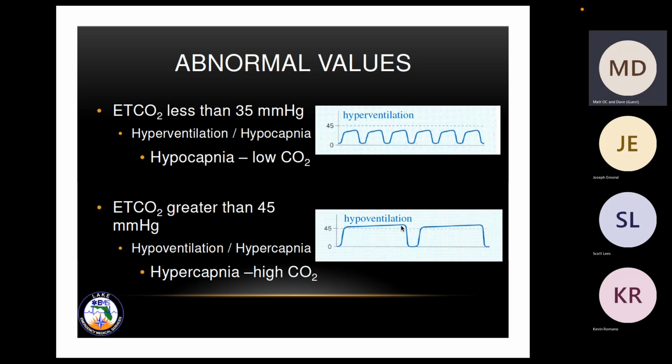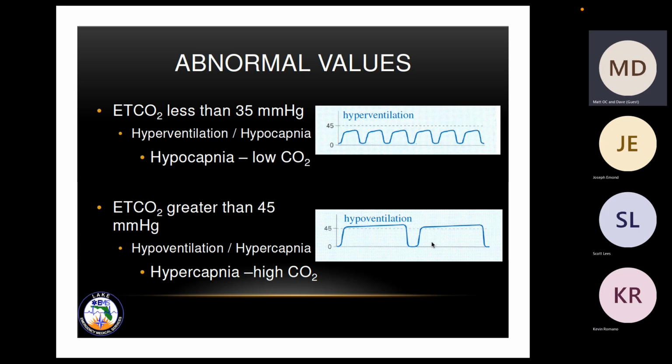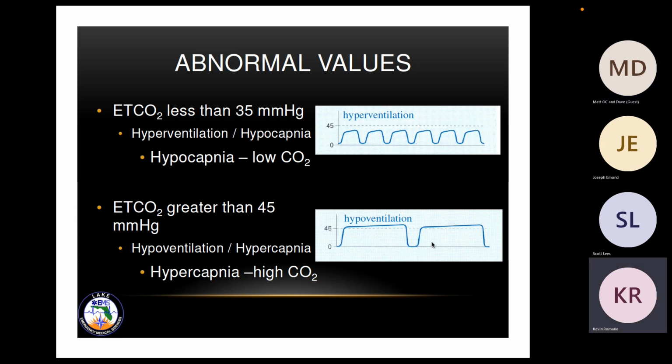But will we still have that long one because we're bagging the person, or will it be shorter? Well, with high numbers, if you're bagging the person, we're hoping that you're fixing hypoventilation and getting them to a rate between 12 and 20 a minute. That's kind of our goal, right? So you should see the numbers when you're ventilating now, BVM, start to decrease and get back into normal range, and you won't see that long pause, the long exhalation phase. Right. So phase 2 would not be as long. Correct.